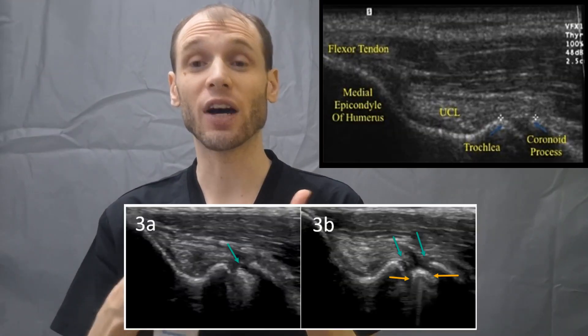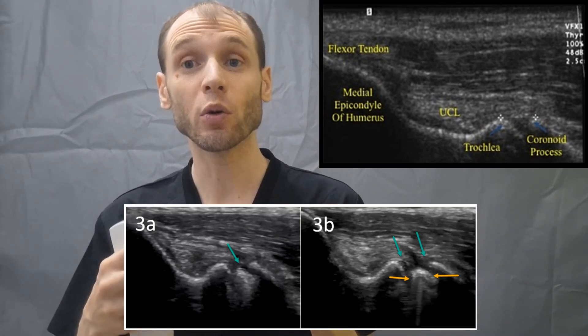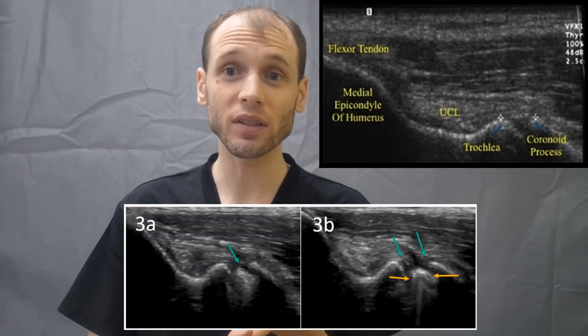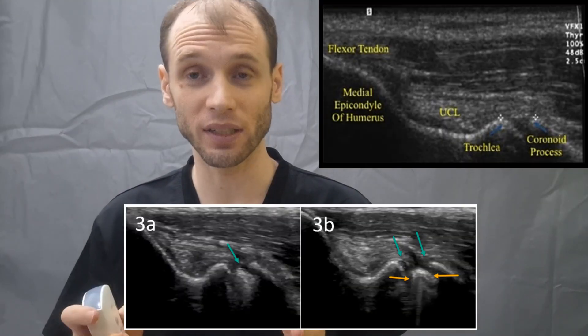What we'll be looking for is fiber discontinuity, whether the ligament is thickened and hypoechoic, and most importantly we'll see if the joint opens. We can look at how much the joint opens, or compare how much it opens compared to the asymptomatic side, and there are thresholds for both these quantities.